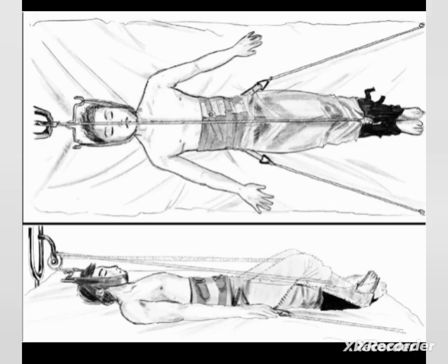Next traction is Cottrell's traction. It is used in adolescents and young adults with a head halter and pelvic belt. So in Cottrell's traction, there will be a pelvic belt and a head halter. Usually it is used for preoperative muscle stretching in patients with scoliosis.